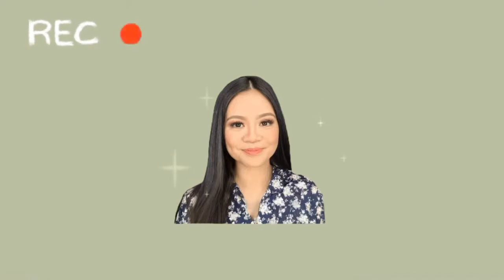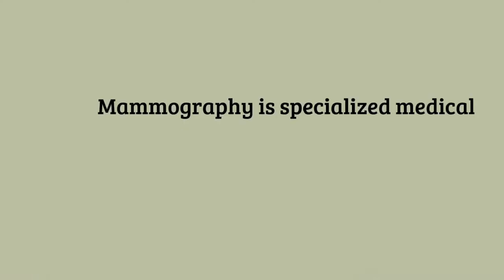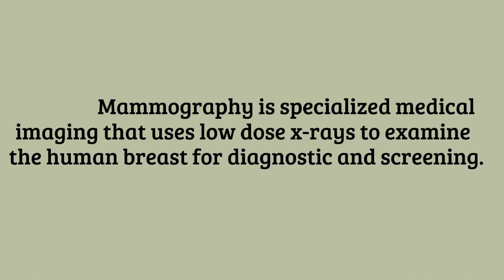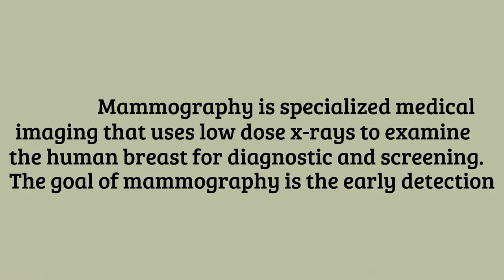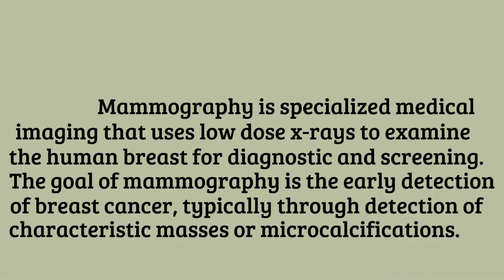In this video, I'm going to show and discuss the mammography equipment with its parts and functions. For the introduction to this topic, what is mammography? Mammography is specialized medical imaging that uses low-dose X-rays to examine the human breast for diagnostic and screening purposes. The goal of mammography is the early detection of breast cancer, typically through detection of characteristic masses or microcalcifications.